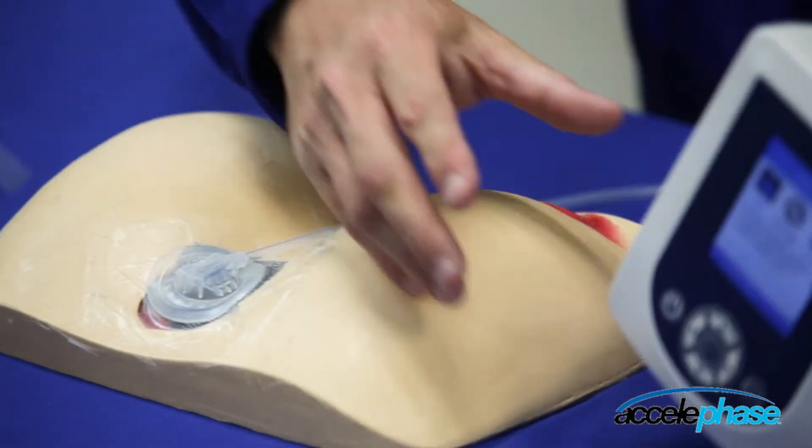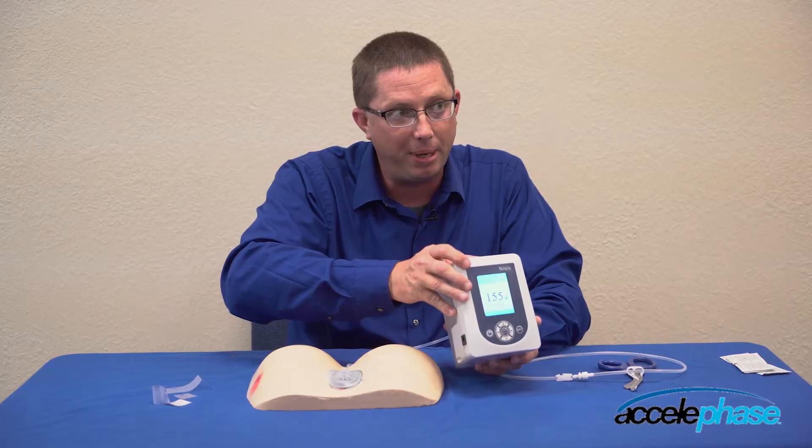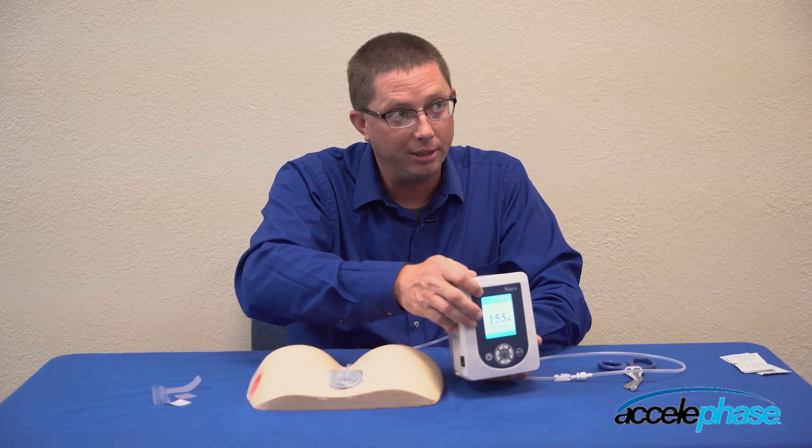If I go over here and look at my pump, I'm going to hit exit and back out to the base menu. The leak alarm is no longer visible. The pump has rectified the situation.